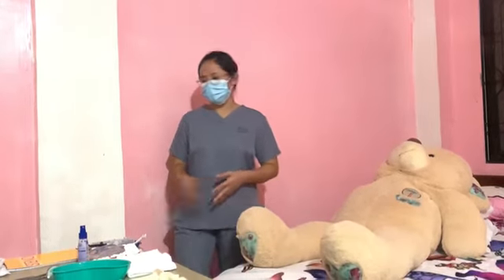Student nurse Rosalinda Ondoy. So today I will be performing insertion of a nasogastric tube. Insertion of a nasogastric tube permits the patient to receive nutrition through tube feeding, using the stomach as a natural reservoir for food. Another purpose of an NG tube may be to decompress or drain unwanted fluid and air from the stomach. So the first procedure is to verify the medical order for insertion of an NG tube.